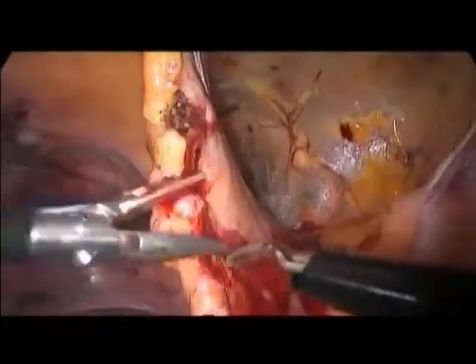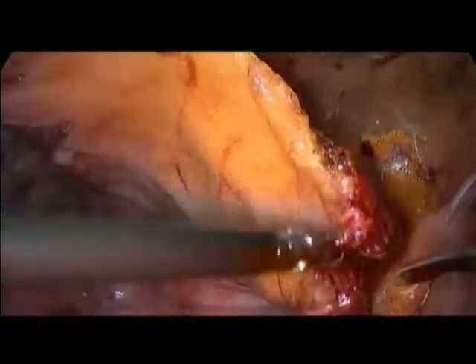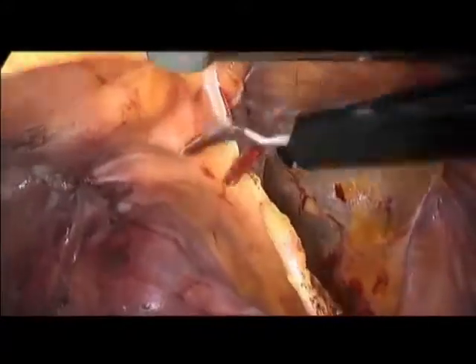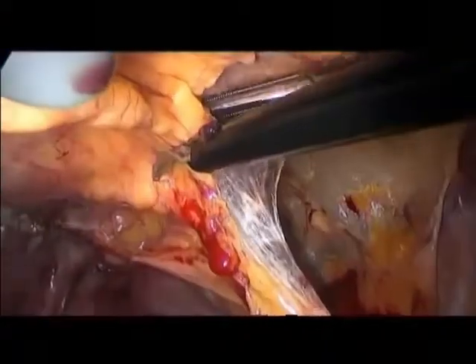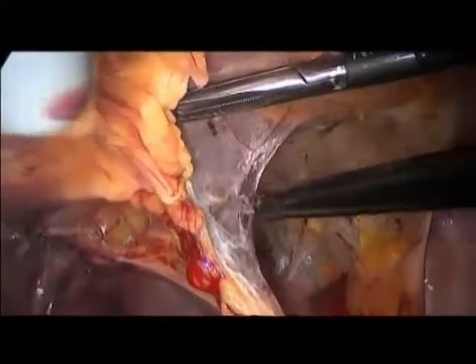We need some control on the cranial aspects, on the caudal aspects of our incisions here. You see that flap is coming very easily. And thereafter, we will be able to develop that space almost bluntly.